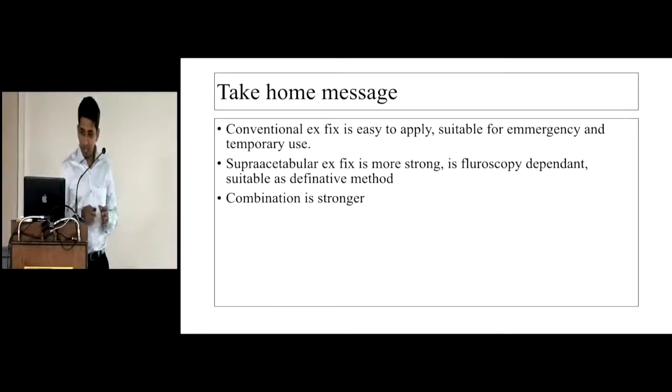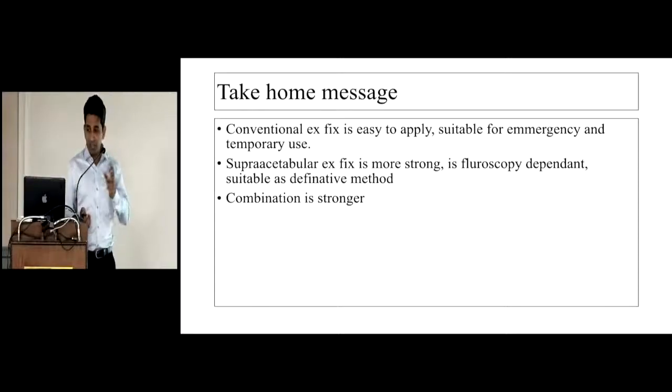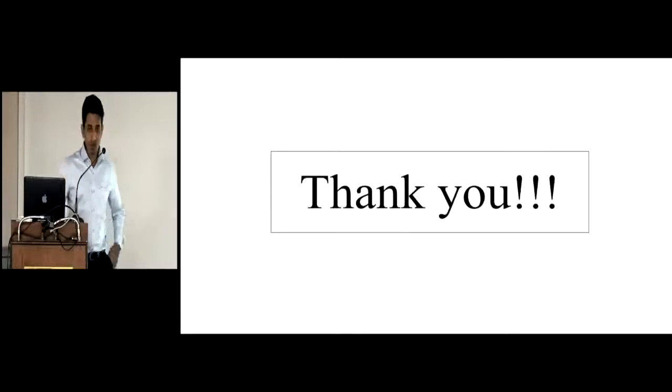So the take-home message is that the conventional fixator is easy to apply, suitable for emergency and temporary use. The supraacetabular fixator is stronger. However, it is fluoroscopy dependent, and it is useful as a definitive method. And I think a combination is a much stronger fixation than using either of these fixators in isolation. Thank you.